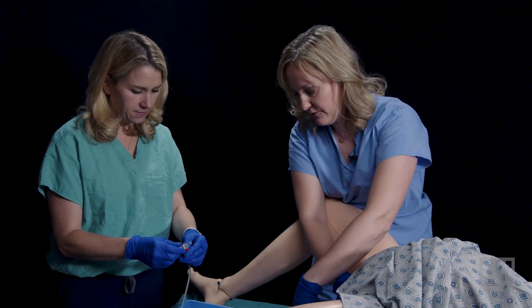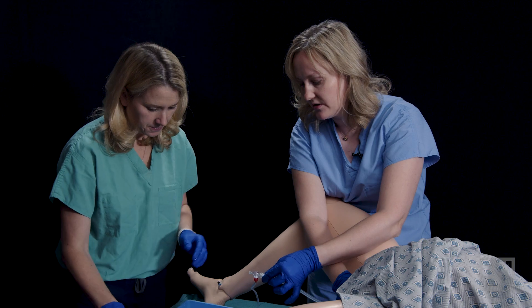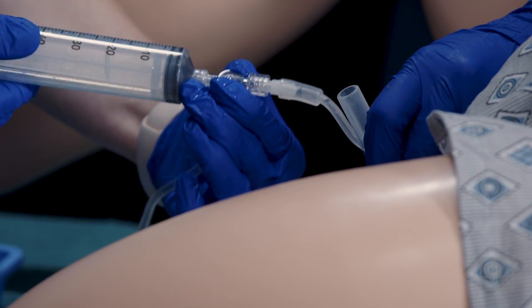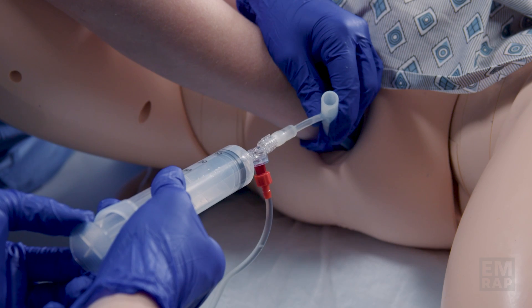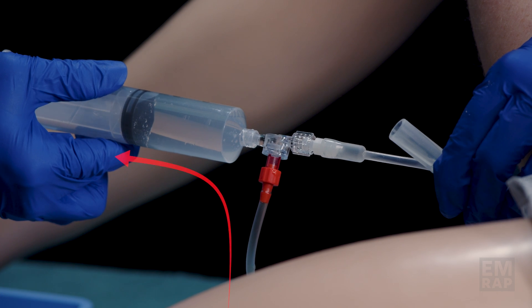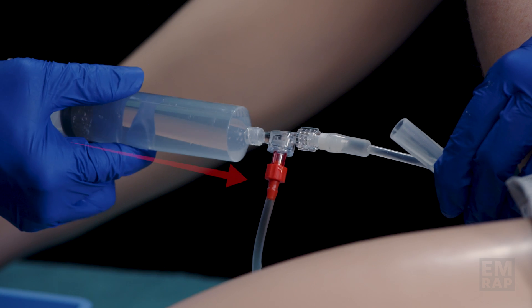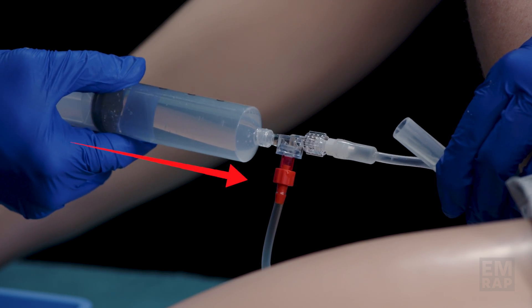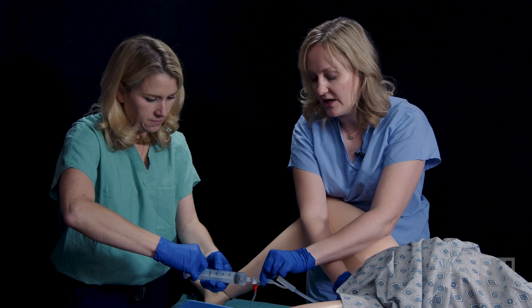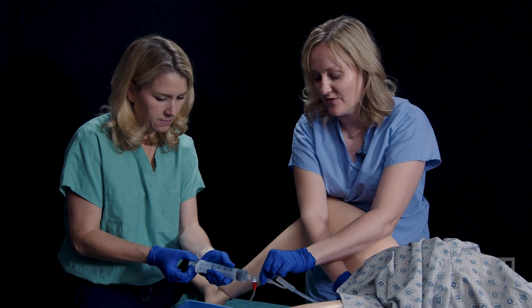This here is a one-way valve. Using the same 50 mL syringe, we're going to connect it immediately to the device. Go ahead and draw back — that should automatically draw up your fluid. Because this is a one-way valve, as soon as she is done drawing up, she can go ahead and instill without actually separating the syringe. You can see now the fluid is going directly into the Bakri balloon. We're going to continue doing this until we have a total of 350 mLs. It's really important that someone is keeping track, because it's very easy to lose count of how many times you've done this.